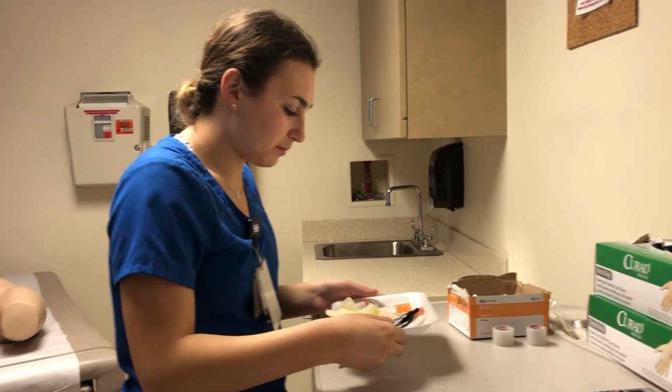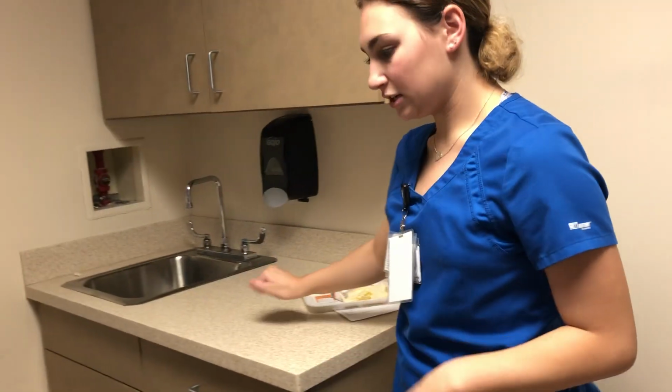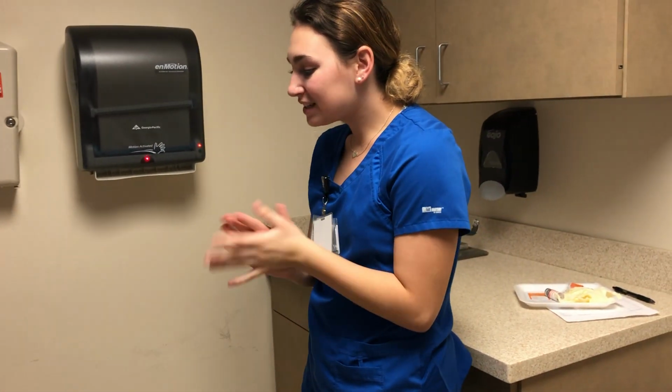So I'm going to take my MAR, my alcohol wipes, and my gloves, and a pen for documentation into my patient room. So I'm going to knock and then wash my hands. Hi there, my name is Kaylee. I'm going to be your student nurse today. And then I would ask how my patient is feeling.